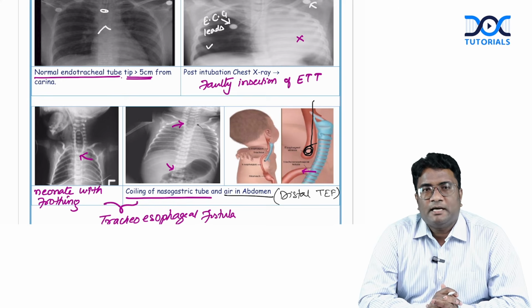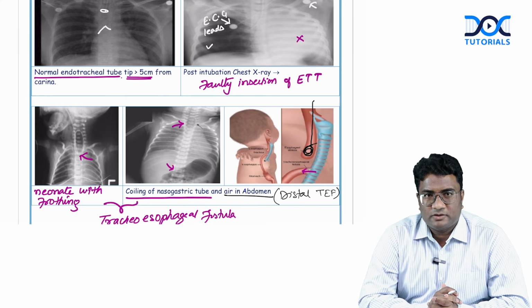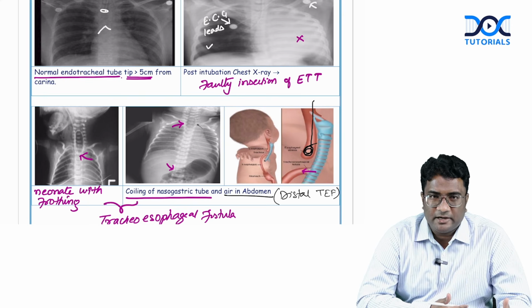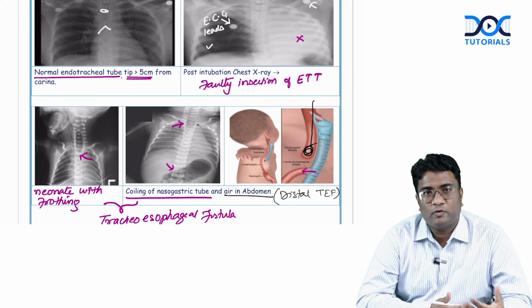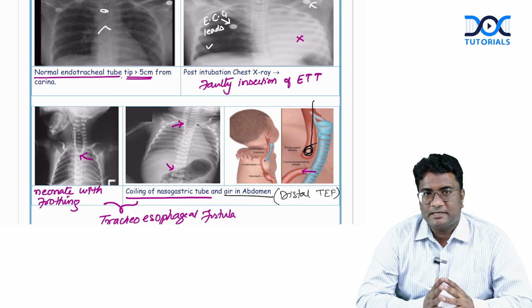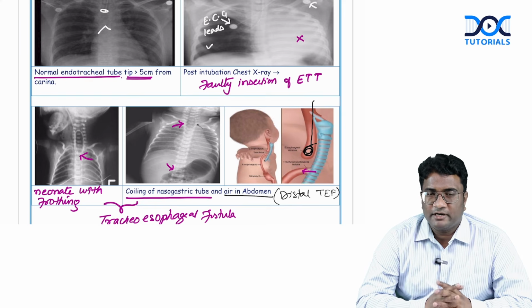So that completes our discussion of X-rays. So we understood how an X-ray tube is, what are the different mechanisms of X-ray generation, what do you mean by Bremsstrahlung radiation, characteristic radiation, what is a Compton effect. We understood what is kilovoltage peak, mAs, and we looked at the different radiographic views for different conditions.